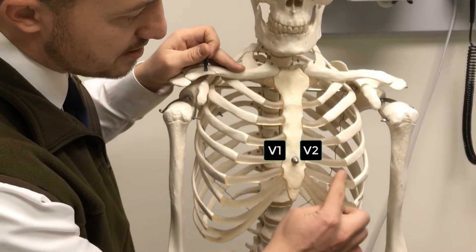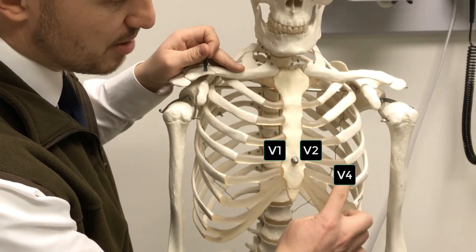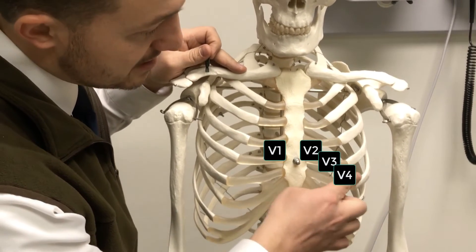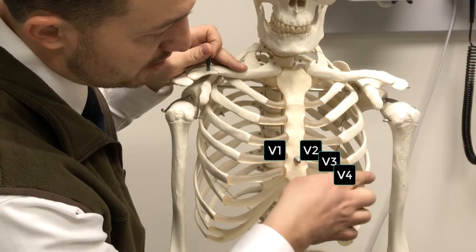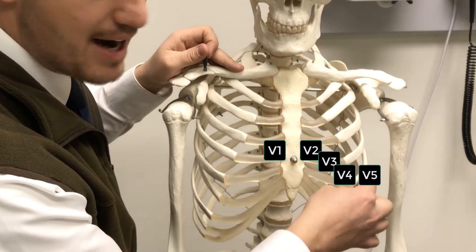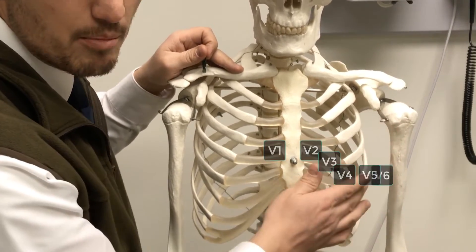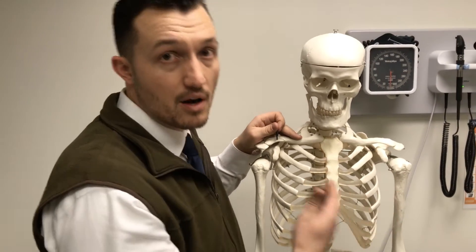Then we're going to go down into the fifth intercostal space out to the mid-clavicular line and place V4, place V3 between the two, and stay in this fifth intercostal space — or at least the same horizontal plane — to go to V5 in the anterior axillary line, and V6 in the mid-axillary line under the patient's armpit. So let's go ahead and demonstrate that now on a real patient.